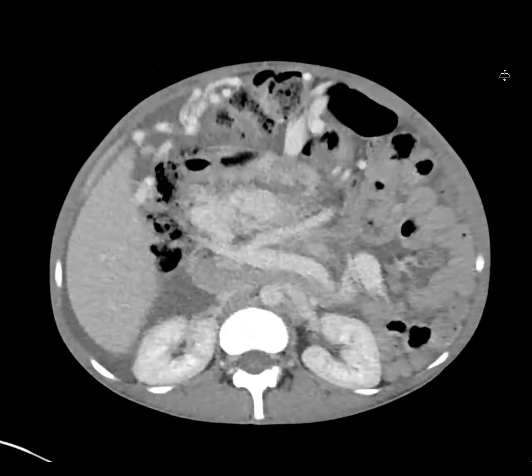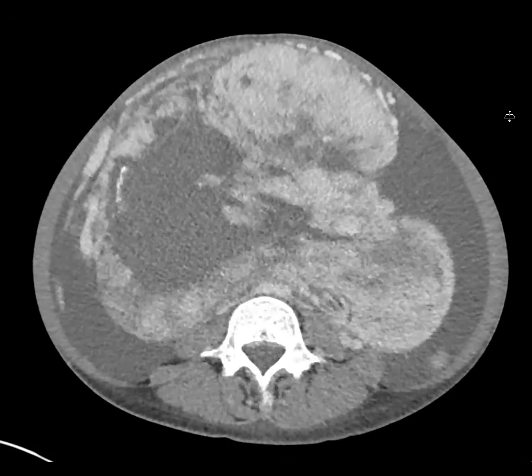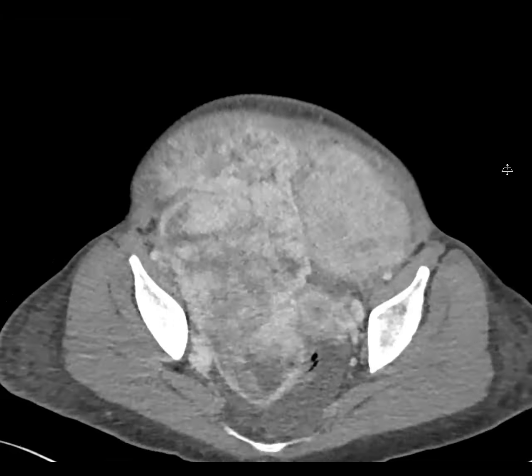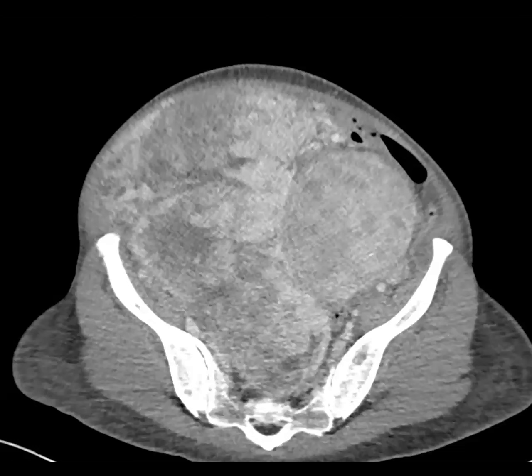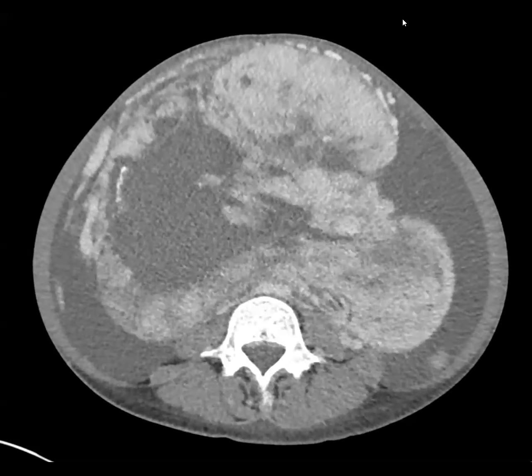So that's the main takeaway: this is great for this patient, this wasn't actually a leiomyosarcoma, but they still need to be followed for a very long time. And I don't think you could ever prospectively call this. You basically go in thinking either it's a fibroid or it's a leiomyosarcoma and it comes back stump. Wow.